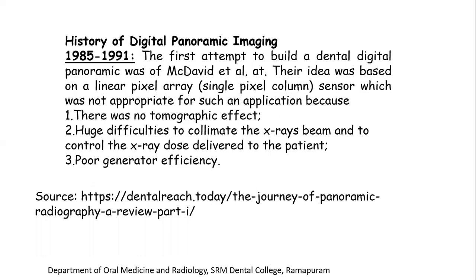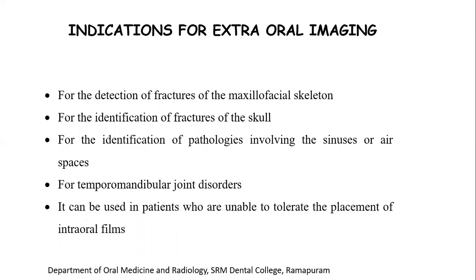It was in the period of 1985 to 1991 that digital panoramic imaging came into place. The first attempt to build a dental digital panoramic was by McDavid et al. The idea was based on a linear pixel array of a single pixel column sensor, which was not appropriate for such an application because there was no tomographic effect. There were some difficulties to collimate the X-ray beam and to control the X-ray dose delivered to the patient, and there was also poor generator efficiency.